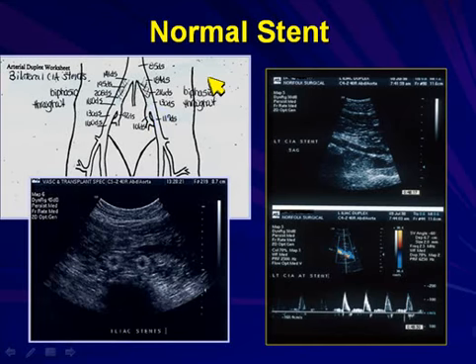Usually if the patient has had a full aorto-iliac procedure and this is just a follow-up to a post-procedure stent, we would just do the terminal aorta and then look at the whole segment of the iliac, since both iliacs were treated. We would walk the Doppler right on through the treated portion of the stented iliac and confirm all of that with spectral Doppler in several areas.